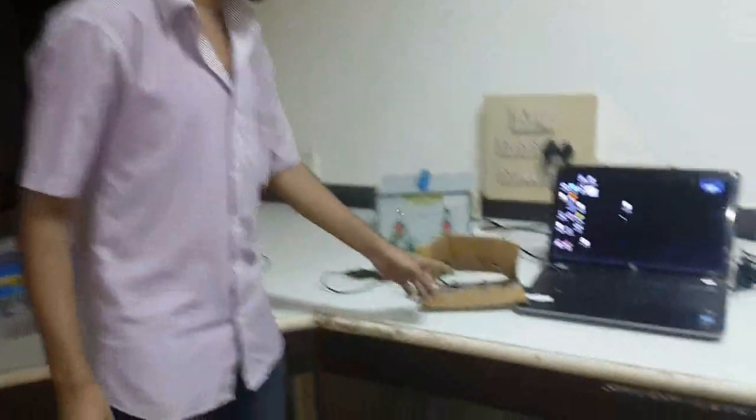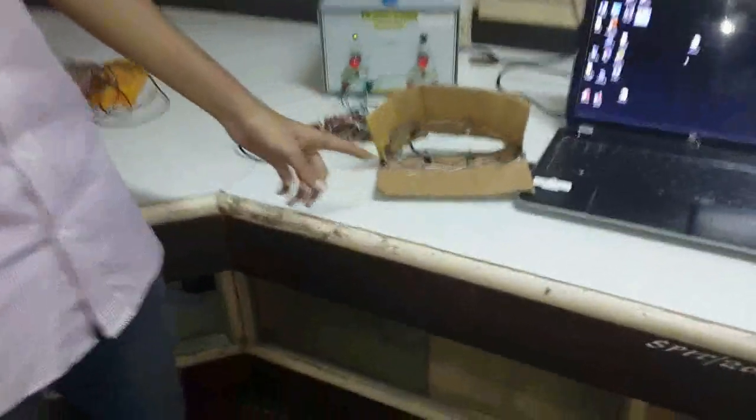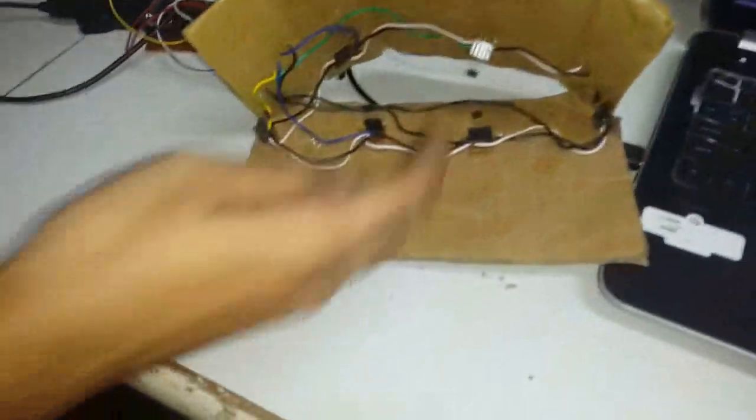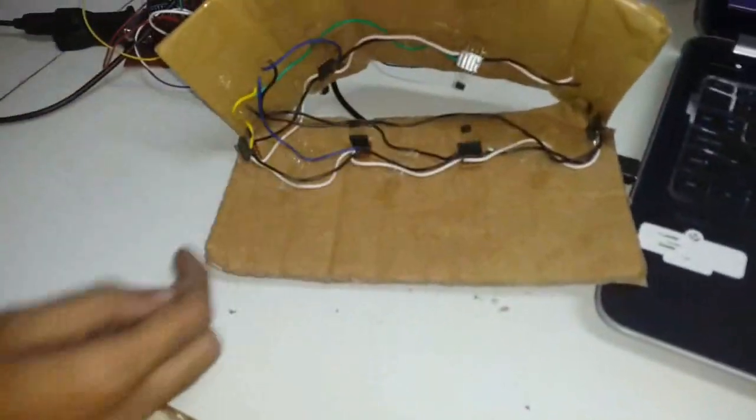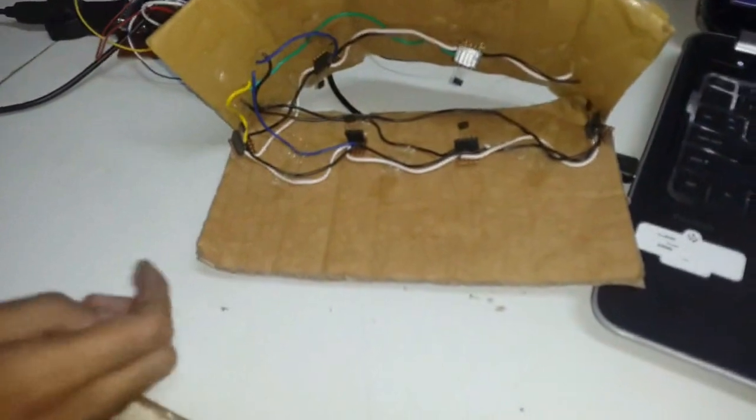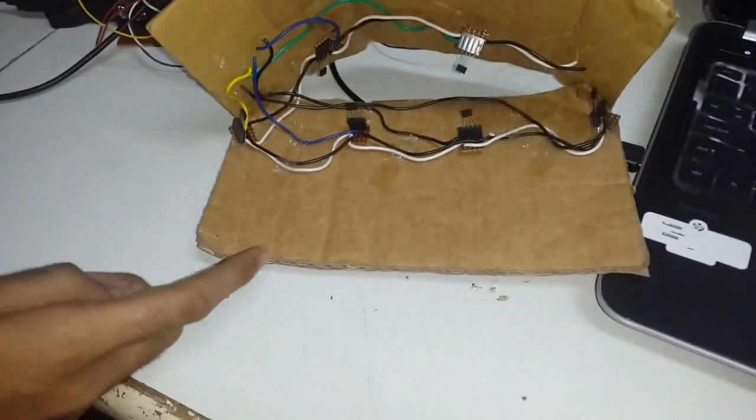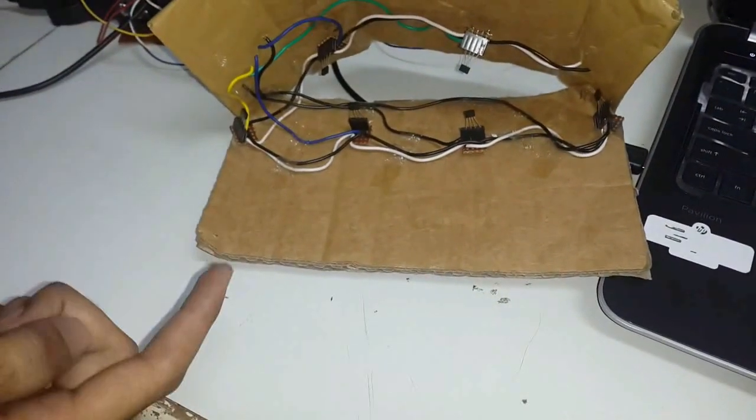This is the prototype of our mouth as explained by my friend. These are the hall effect sensors. Here we are using six hall effect sensors to give six different commands.